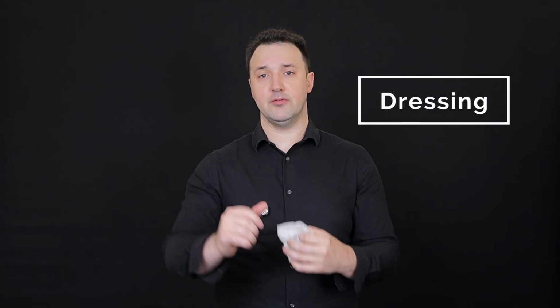Why care? Dressings and bandages. This is a dressing. This is not a lot of dressing. This is a thin one, not going to go very far, not for a big wound style dressing. What is a dressing? A dressing is something that you put on a wound to cover it, to soak up blood, protect it from infection, etc.